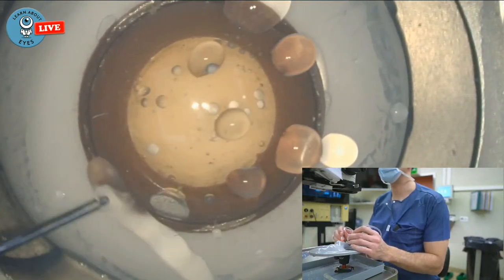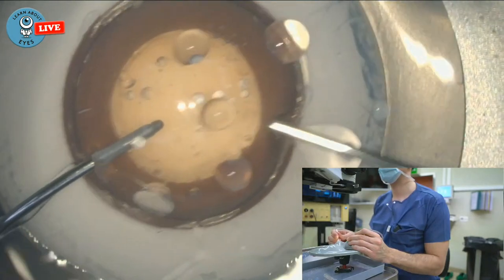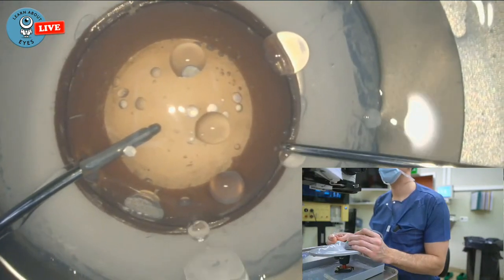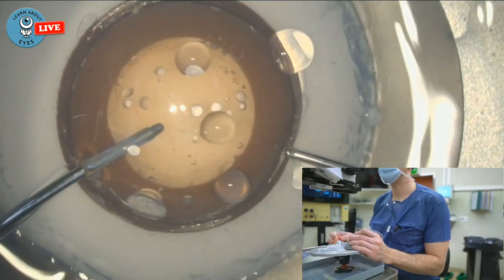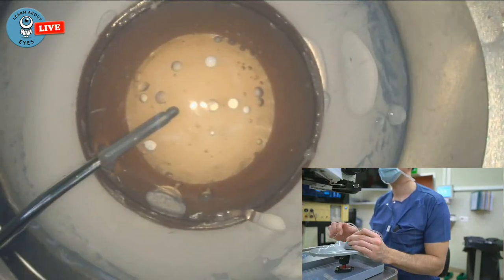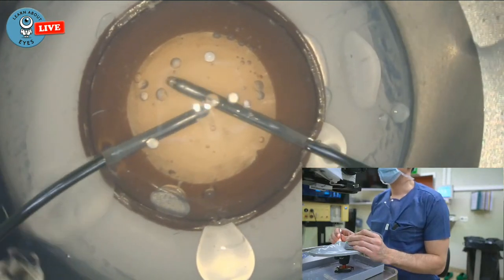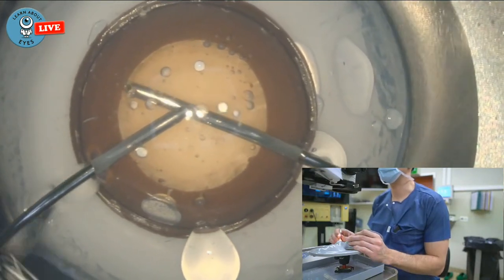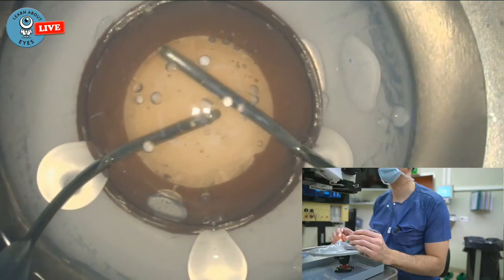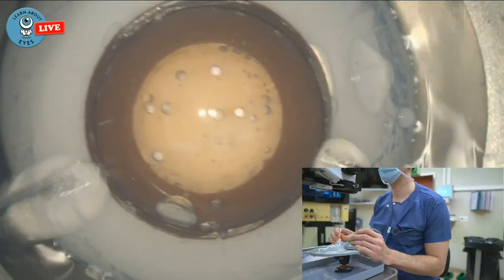Okay. So you would usually turn it on, go in here, if you can find it. And it is super sticky here. I have this problem all the time with these eyes. It kind of sealed pretty well. There we go. Now I have, and silicone, the silicone kind of makes the water pearl on it. So you can just practice using your IA probe. Try and keep the irrigation deeper than the aspiration and just kind of take the cortex out. Try only to aspirate while you have something, switch, and then that's it.